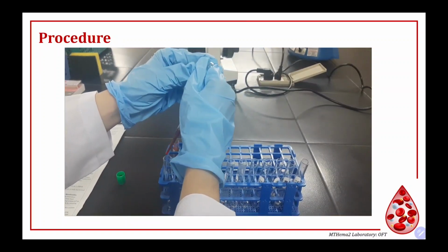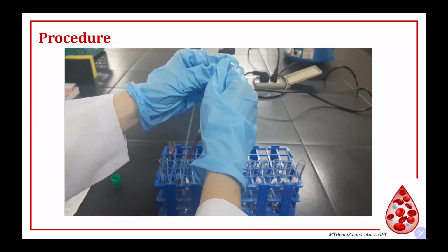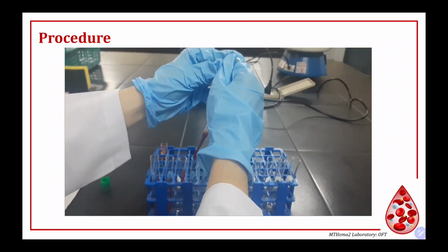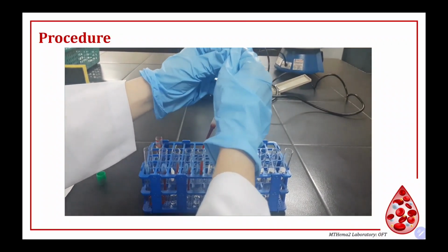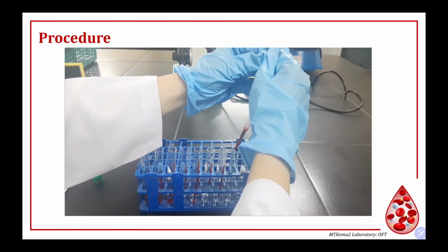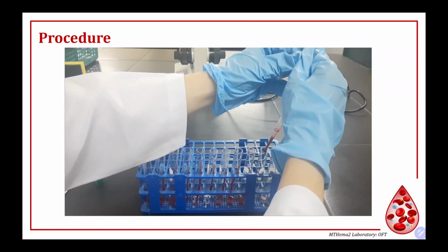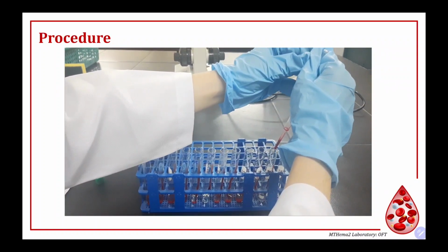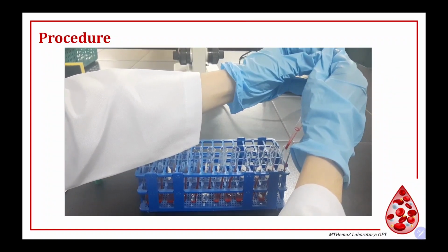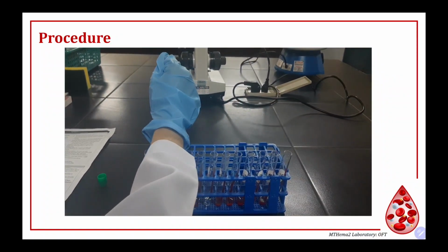Once the solution is ready, place a drop of blood on each tube, which is done in a uniform way, and are mixed gently afterwards. After a 30-minute incubation at room temperature, the tubes are then centrifuged and results are either observed through the supernatant fluid and measured spectrophotometrically at 540 nanometers, or just examined visually on a bright light.